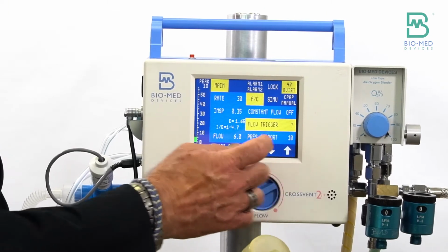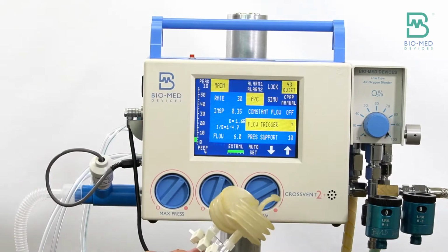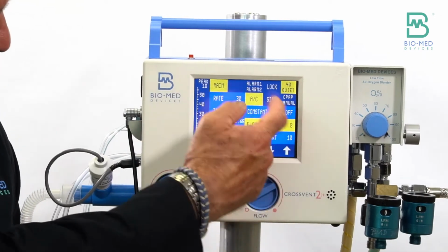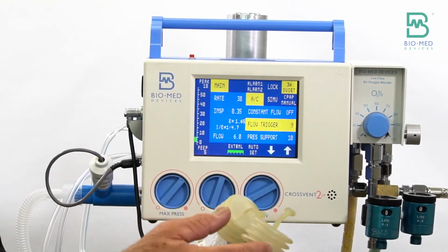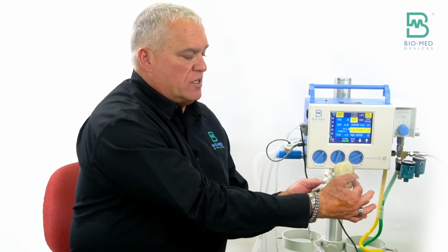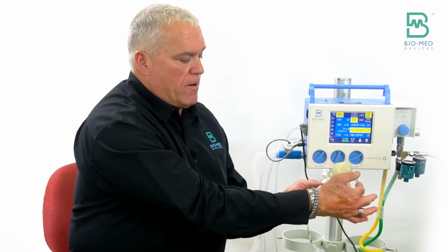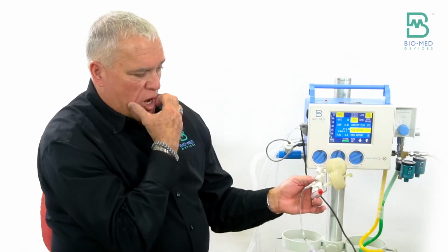If it auto cycles at 7 in this case, what I want to do is not go up just 1 because you're probably right on the edge, go up 2. So now I'm at 9, and now you can see it's just as sensitive as it was before. This is really, like I said, all dependent on the leak.